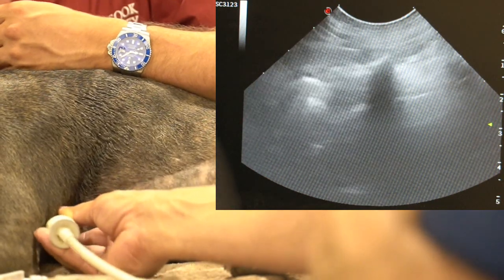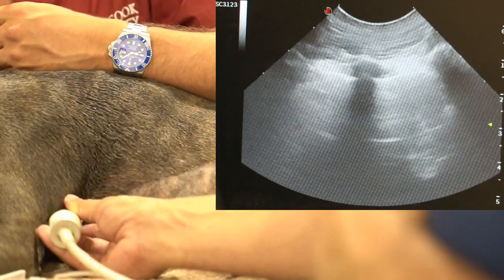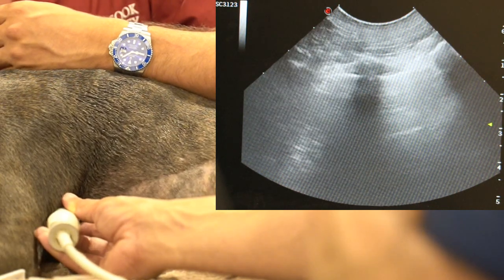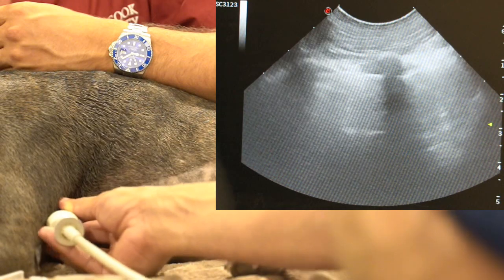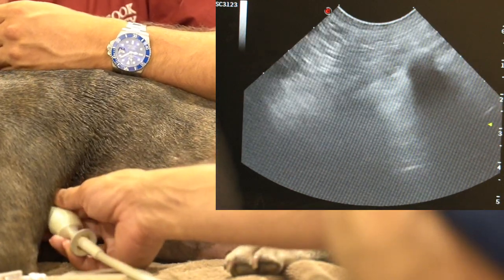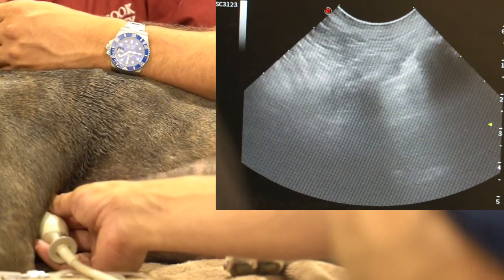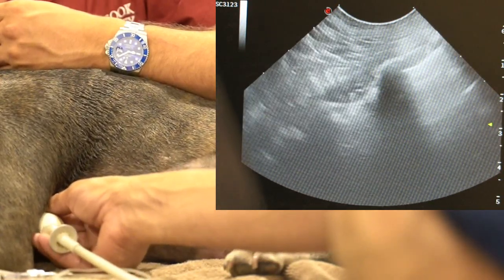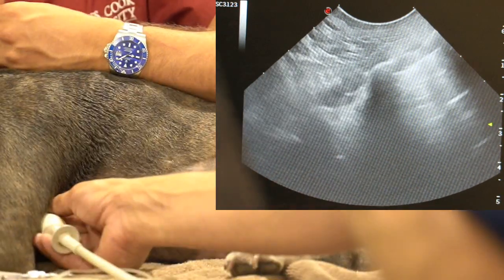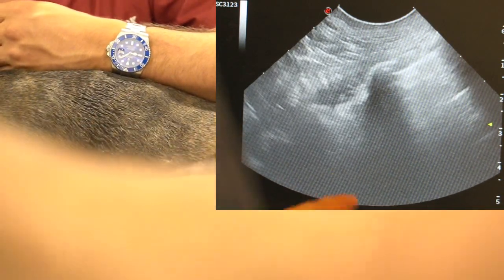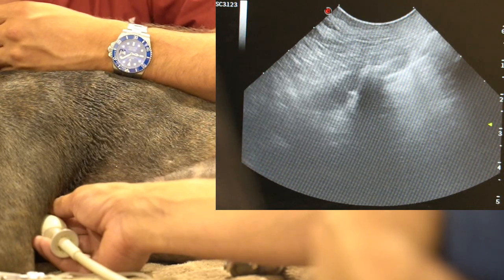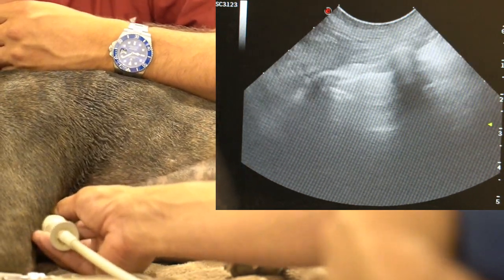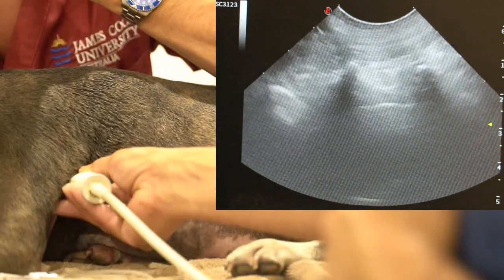That's the bottom of the Nike tick. We fan around here looking at the most ventral aspect of the lung fields, and we have A lines again — showing dry lung — and glide sign again, telling us the lungs are adhered to the chest wall at that point. Then we go up under the armpit looking for lung, and we have A lines again along with a small minor glide in that area. So we have dry lung with lung adhered to the chest wall — like a reverse Nike tick — and we're done.